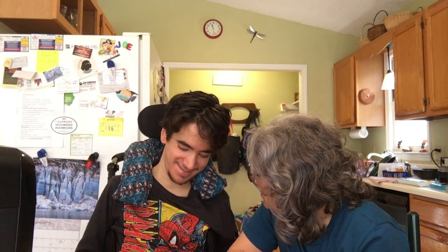And why is this important? Because if Joe could do some things on his own, if he could use this button to communicate with me, he could be more independent. Isn't that great? I see that big smile. Who doesn't want to be more independent?